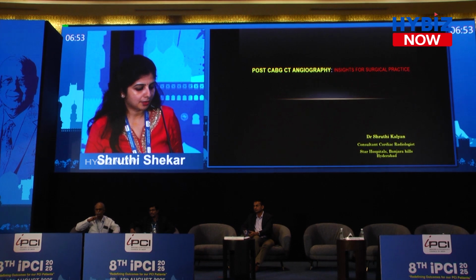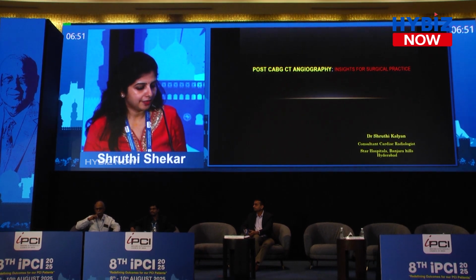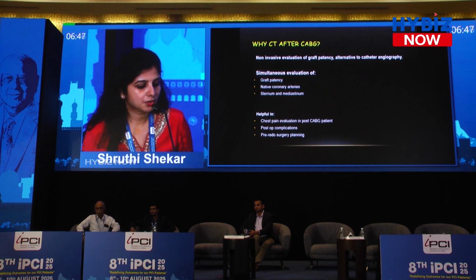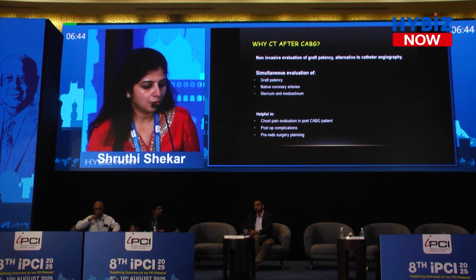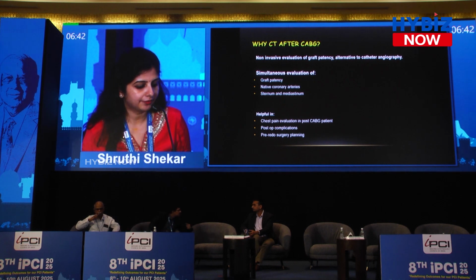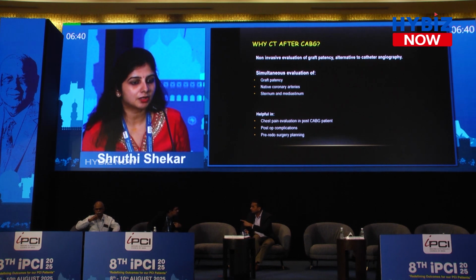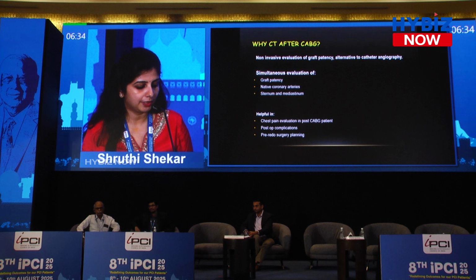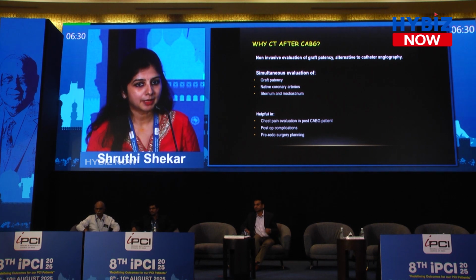So a few words about CT angiography in post-CABG patients. So why CT after CABG? We all know it's a non-invasive technique for the evaluation of graft patency. It's an alternative to catheter angiography. So not just do we look at the graft patency, but we can also evaluate the native coronary arteries as well as the sternum and the mediastinum in one go.